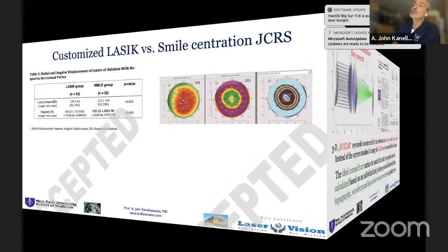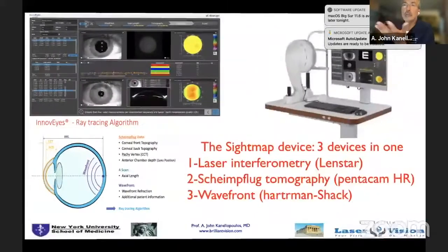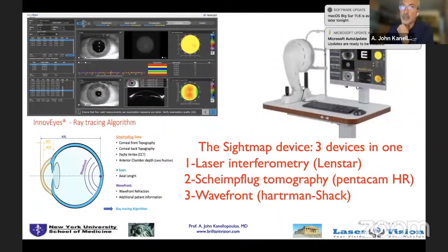And of course, all this work is confirmed. I know it's not our subject today, but I'm going to brush a little bit with the technology and development, the ray tracing, which shows us that when we leave the artificial intelligence to study all the higher aberrations and the objective data and lining up the optical parts of the eye, we're getting better visual acuities.